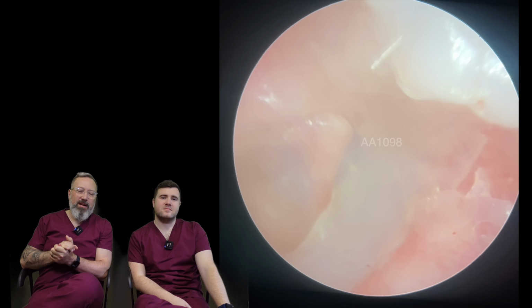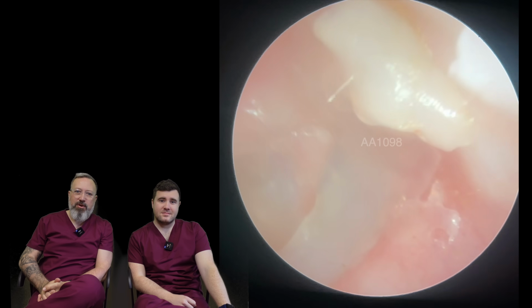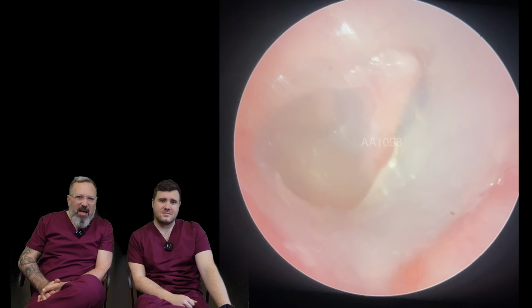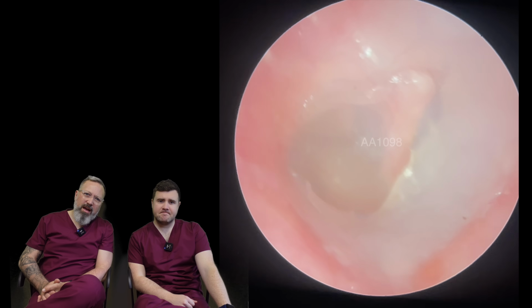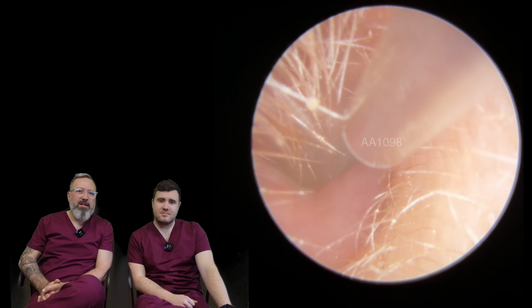Now, when you take a look in this ear canal, what do you see, guys? Because Claire, our healthcare assistant, who was taking a look at this, just said, look, there's something going on here, and I don't know what this is. And I looked in there, and I was like, yeah, I can see what you mean. I can see the eardrum, but it doesn't look quite normal. And I said to the chap, look, you don't use earplugs by any chance? He went, you know what, I do. I use silicone earplugs.